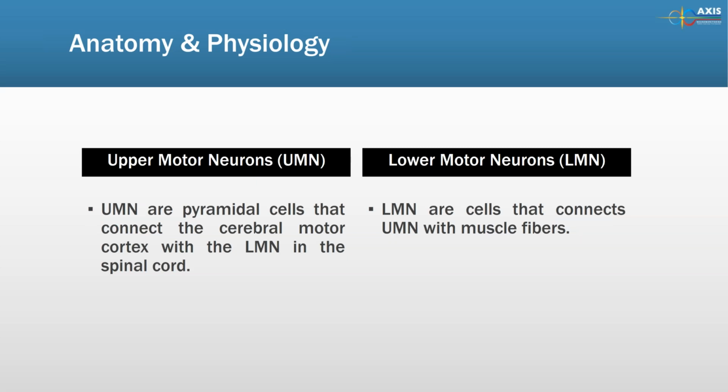So that's why, for motor evoked potentials, anesthesia affects mostly the spinal cord by blocking those interneurons.